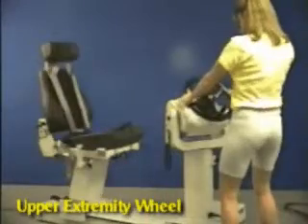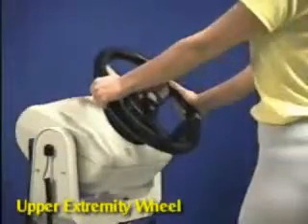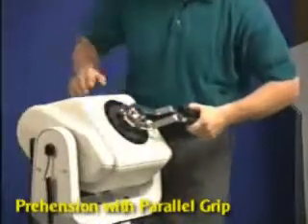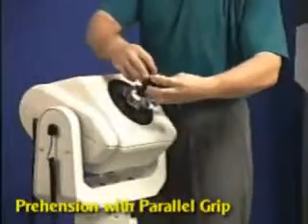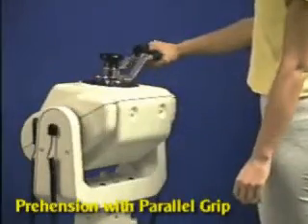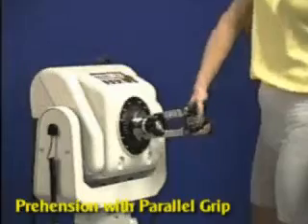Switch to standing position simply by rotating the dynamometer to the opposite side. Install the prehension with parallel grip tool to the dynamometer shaft. Adjust the dynamometer to accommodate a variety of prehension and pinch exercises.